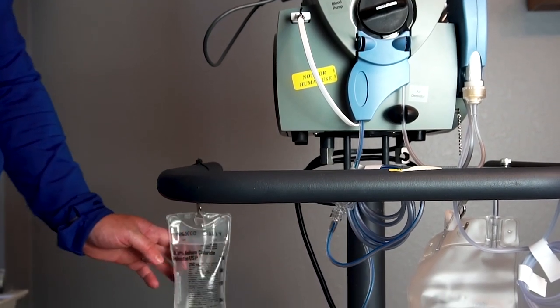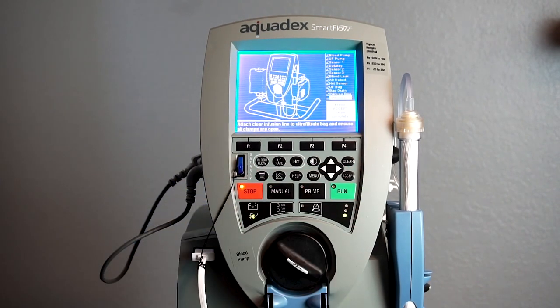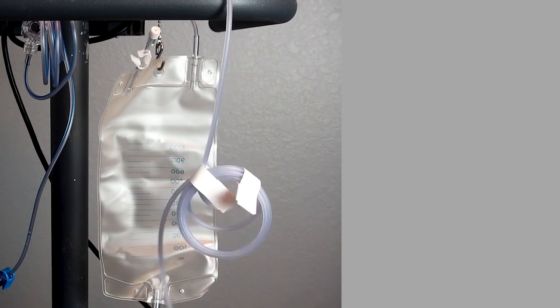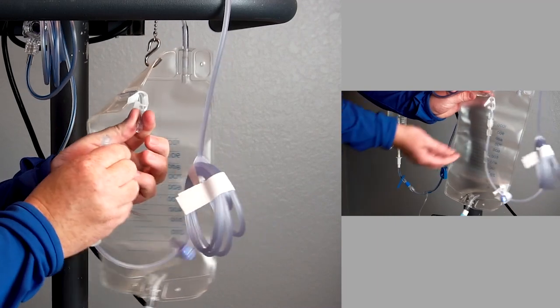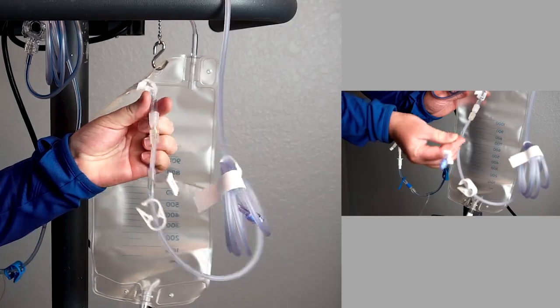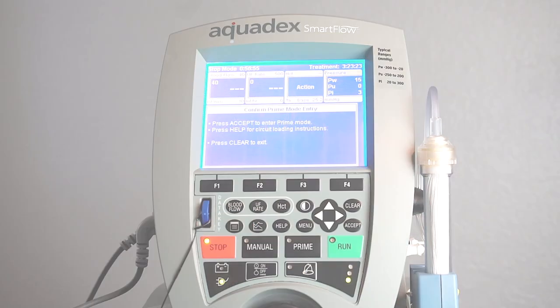The priming bag is provided to the left of the console, either above or below the bar. Press accept when complete. Attach the clear infusion line to the UF bag and ensure all clamps are open. Press accept when complete. You are now ready for priming the circuit.